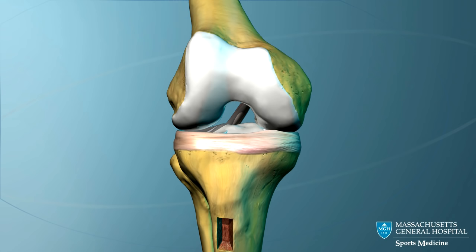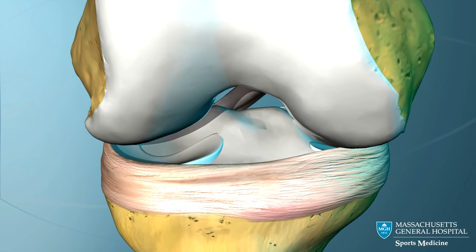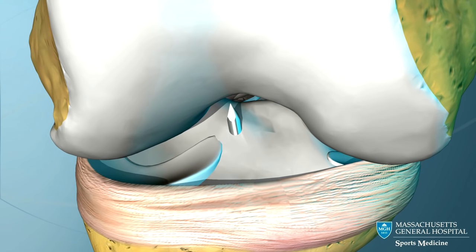To create a tunnel in the proper location in the tibia, a guide pin is passed through the upper tibia. It enters the joint at the spot where the ACL normally attaches to the tibia.